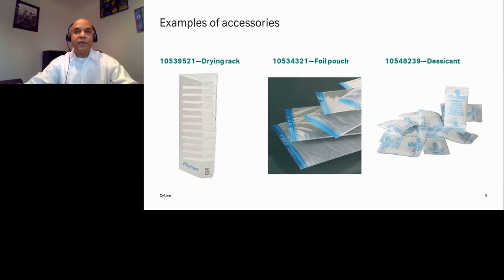The blood spot should then be allowed to air dry and ideally stored in low gas permeable bags that contain desiccant to reduce humidity. Samples can be tested immediately, stored at ambient temperature, even under tropical conditions, or frozen at -20 degrees Celsius, where the level of IgG antibodies may remain stable for several years.